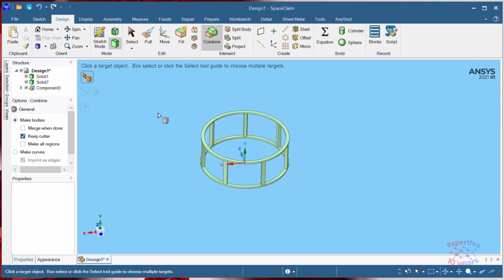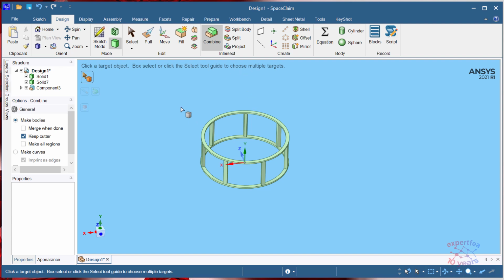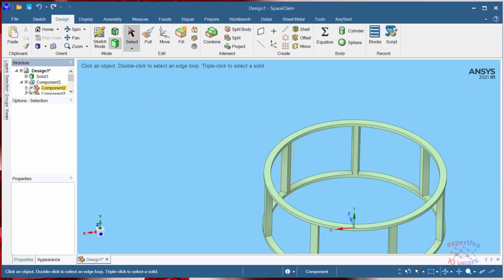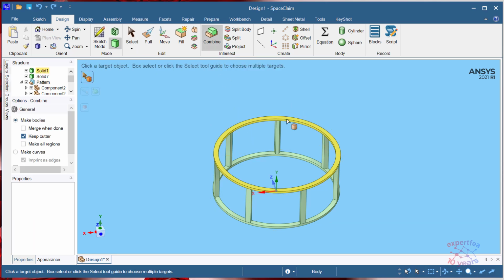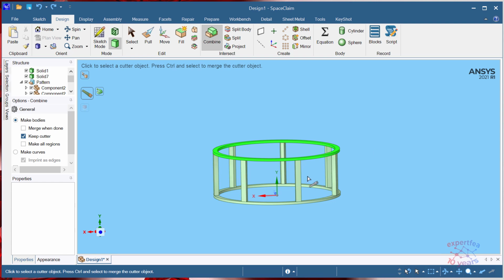The easiest method would be to select all of them, but we can see that they did not unite here. Let's click here. Yeah, something occurred. This means that is this? Yeah, it's not useful. So let's do it the proper and with no hurry method.